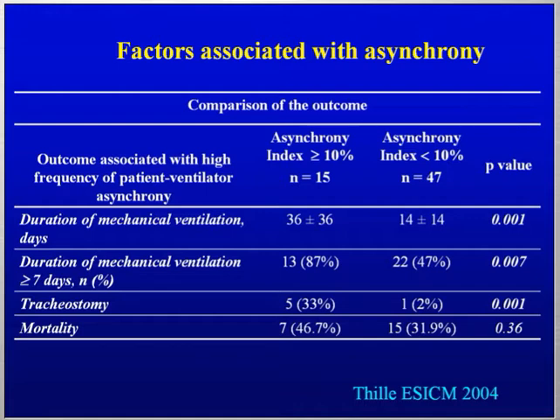Did you find a correlation with the level of intrinsic PEEP in the missed effort phenomenon? We did not measure it. The point was really to have the prevalence of this phenomenon. So in every consecutive patient, every day, without changing anything, we recorded 30 minutes of ventilation.